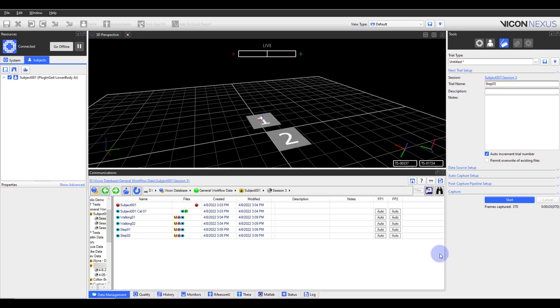If a C3D is saved with only the preview data, Nexus will not access the complete data stored on the sensor, even if it is later transferred. The sensor data can then only be accessed if the C3D file is deleted.